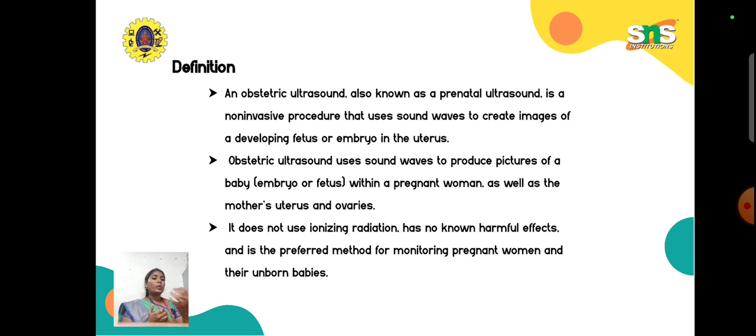That reflected frequency is collected by the same probe, which converts the signal into equivalent intensity. This intensity is mapped in the form of an image. An image is a group of pixels which carry the intensity, so if you place the intensity in the respective pixels, at last you get the image as a whole. That is how ultrasound works.